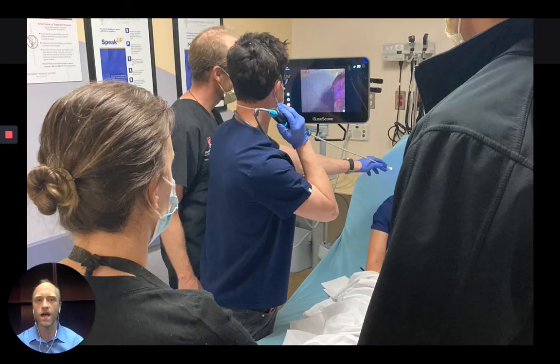At this point then, I encourage learners to use their new skills as frequently as possible in the ED. Topicalize your patient and perform nasopharyngoscopy instead of ordering a CT for that patient with severe odynophagia or a hoarse voice, or just take a look in that patient that swears he has a fishbone stuck in his oropharynx. There are multiple opportunities to use this skill in the ED to build your skills.